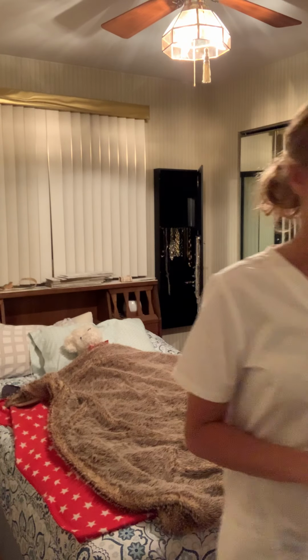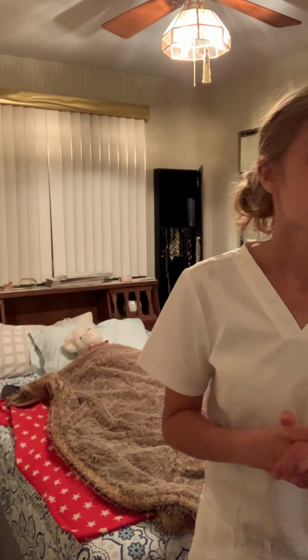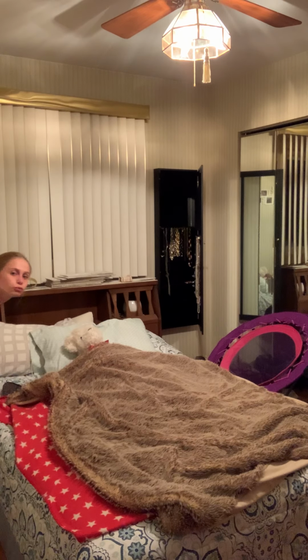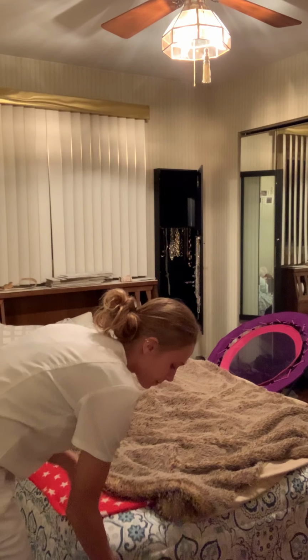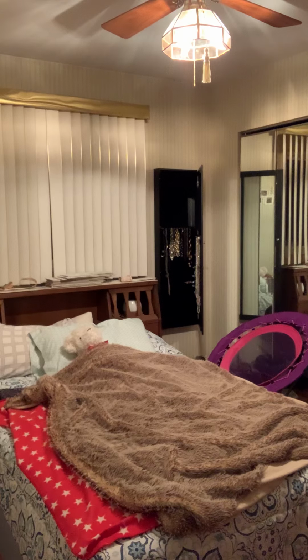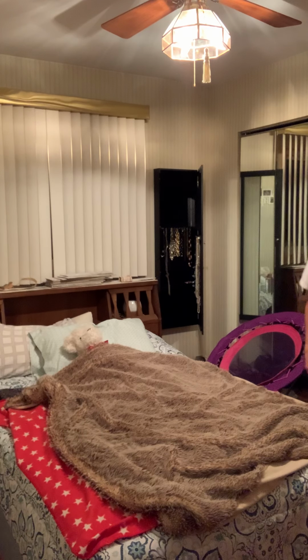So now we are going to be tucking in the sheets. So, well, the top linens. So we are going to raise the mattress, tuck the top linen in, raise the mattress, tuck the linen in, and repeat along the length of the bed.